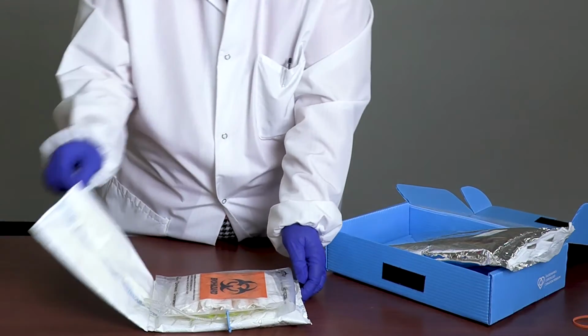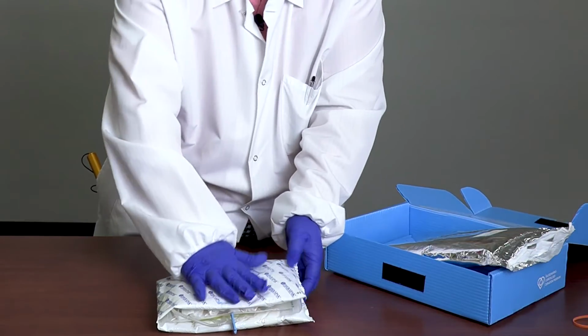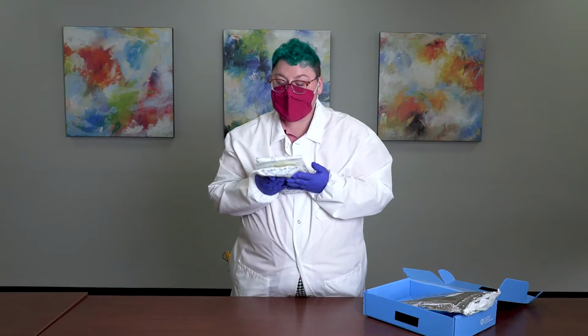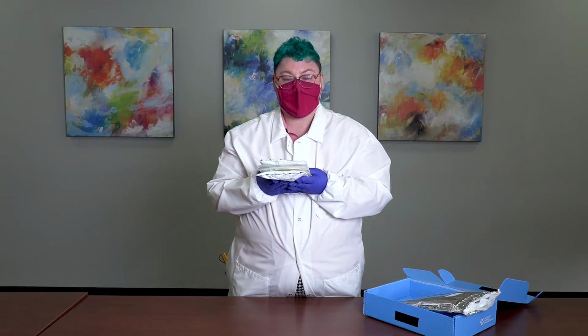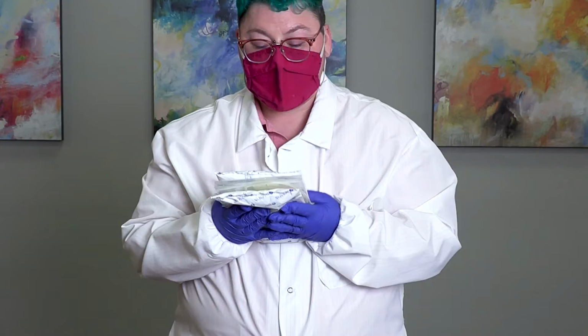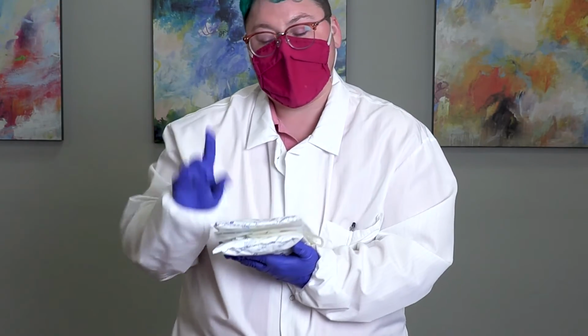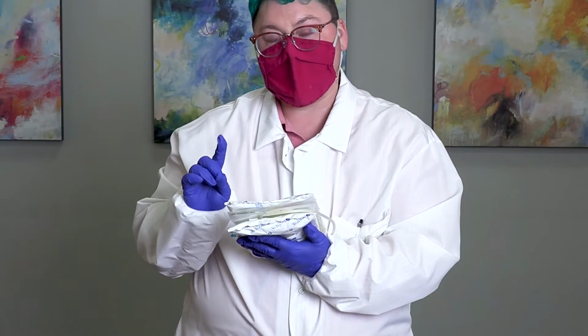The gel pack will be gently folded over, and the seams should be even. We suggest thinking of a sandwich when you package your unit. You want the edges of the crust to be nice and even. We don't want any burritos. We don't want any tacos. We'd like a nice sandwich.